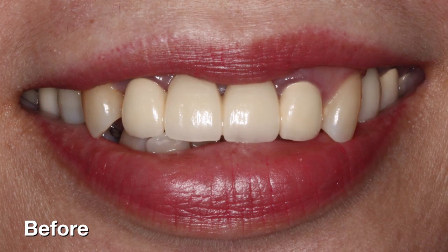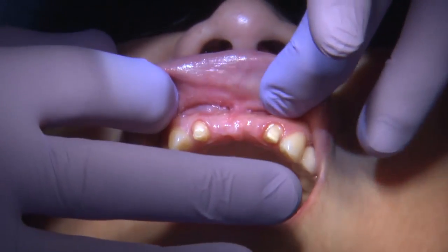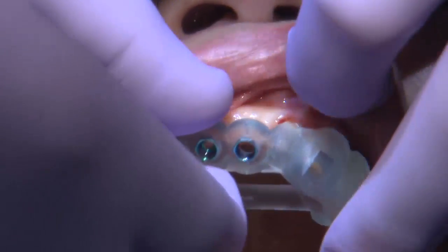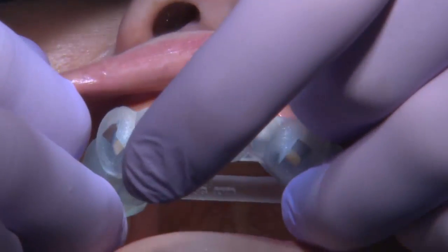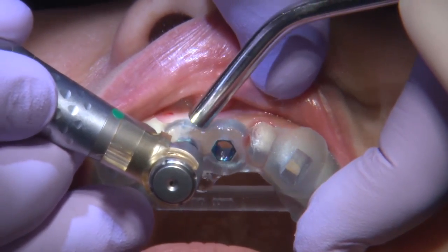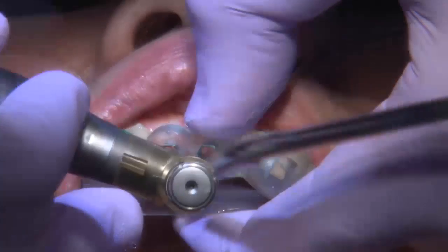Welcome back to the Chairside Case of the Week. My name is Dr. Bai, and I want to share a very special case. This patient came to our clinical operatory here at Glidewell with an existing fixed dental prosthesis spanning from teeth number 7 to 10, and she requested that this bridge be replaced — first for aesthetic reasons, but also because there were open margins around this restoration. Another request from the patient was that she wanted individual teeth so that she can floss between them like she did with her original teeth.